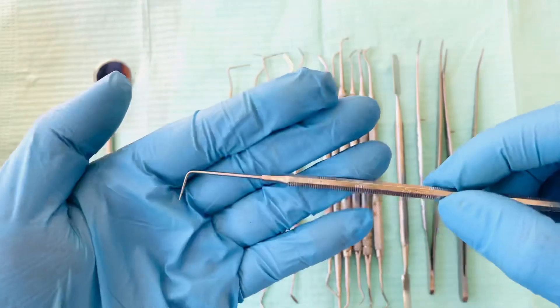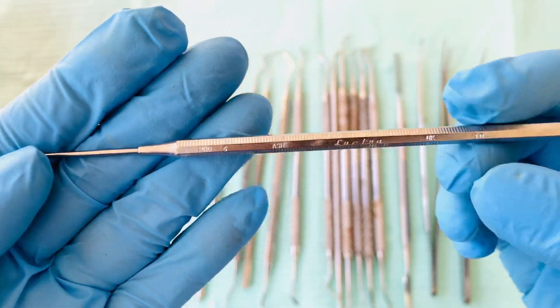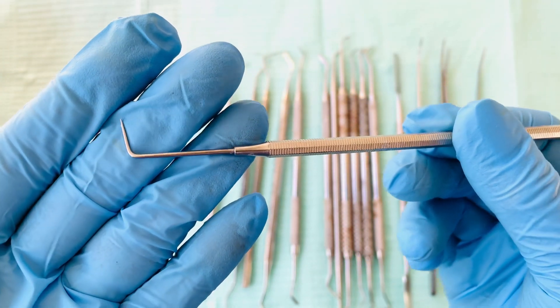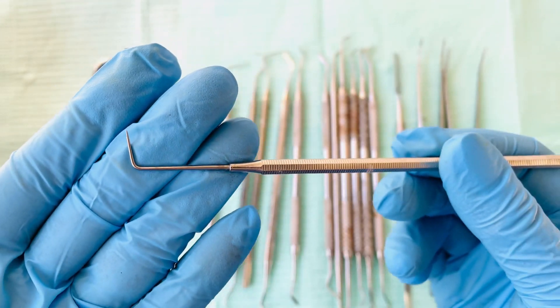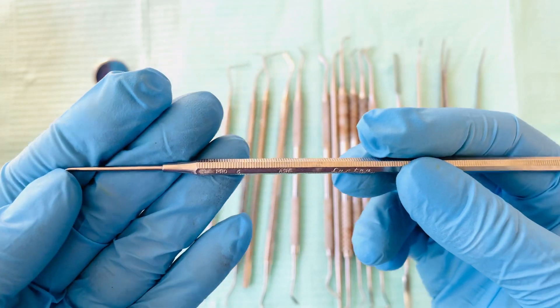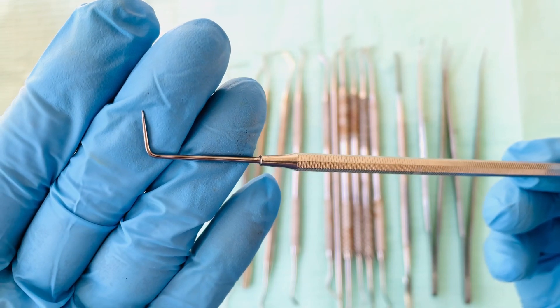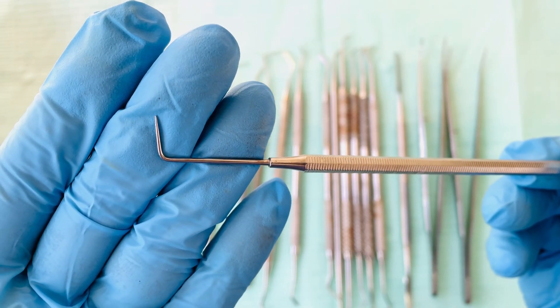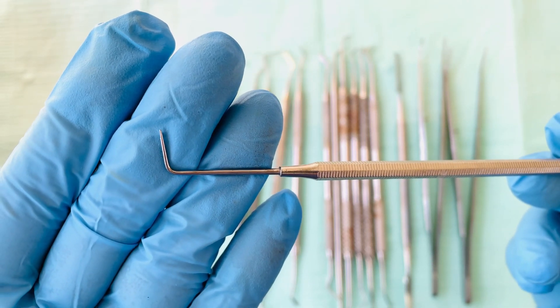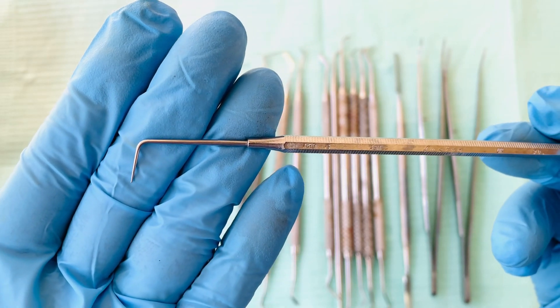Next one is the straight probe. The straight probe is used to check the hard tissues or the teeth; it's used to detect caries on different surfaces of the teeth. Different clinicians prefer different probes — in the UK, most clinicians use the straight probe.